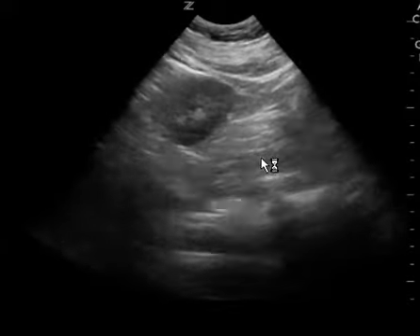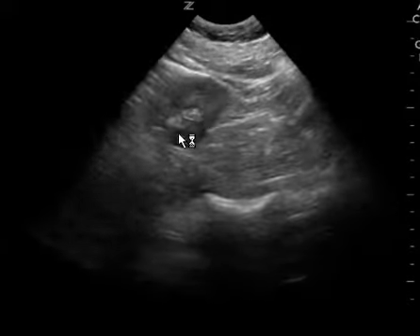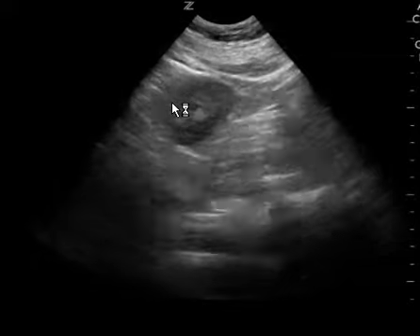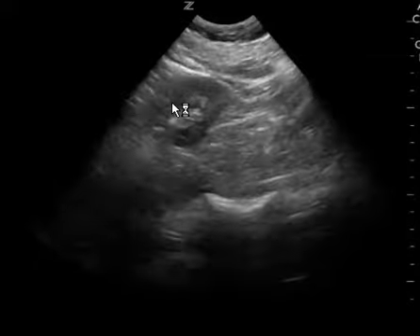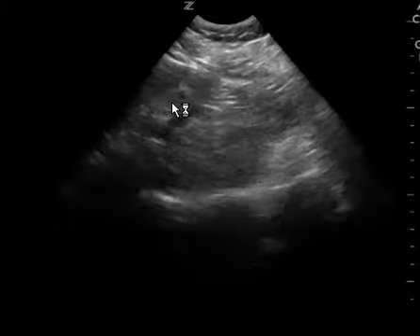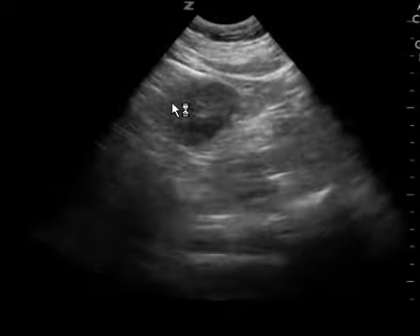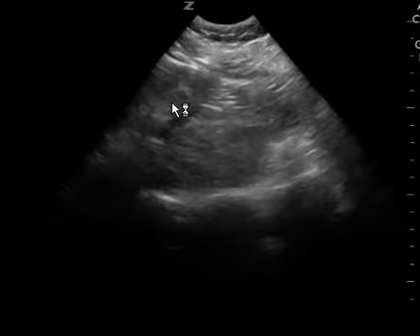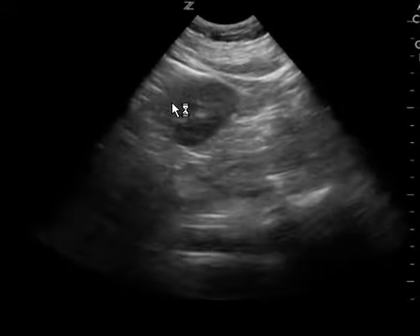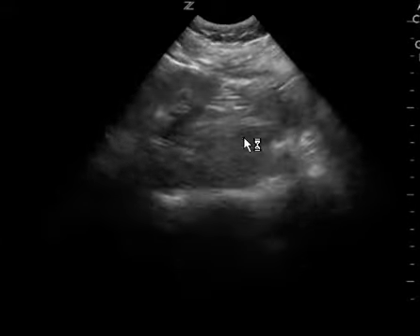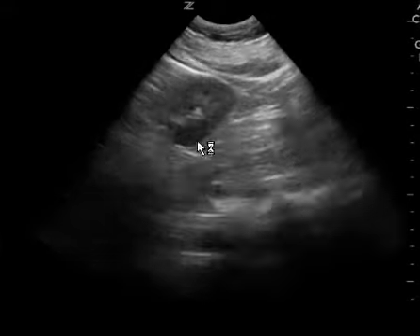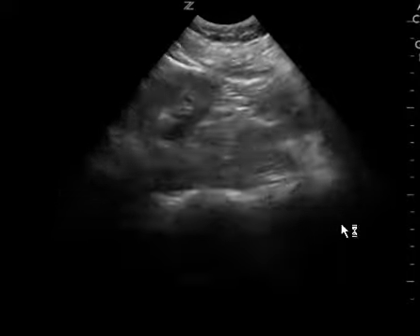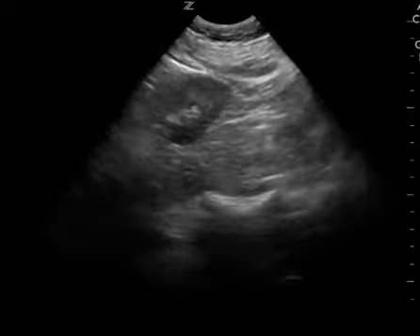And then you move to the left upper quadrant. You can see the kidney here, but you don't see the spleen. And so with this image here, you're too far inferior. And so this is another example of how you don't see all the anatomical components that you need for a FAST exam.